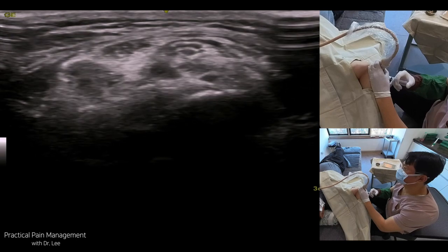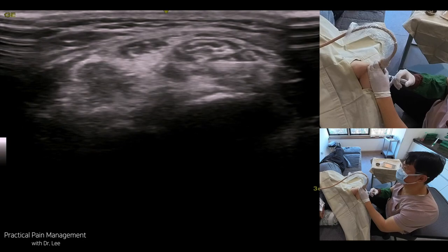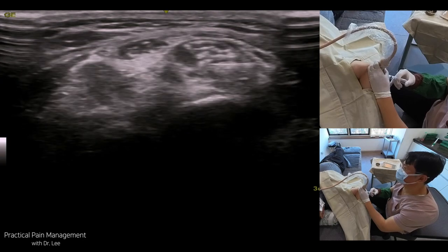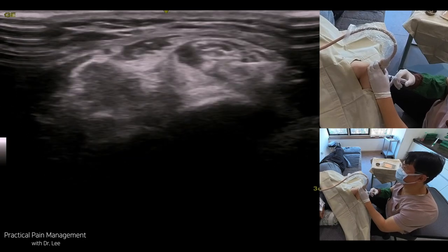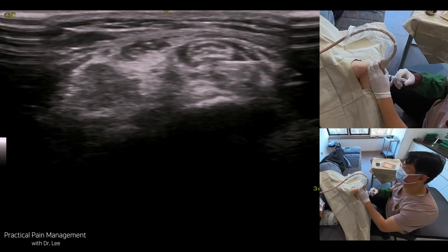Ultrasound-guided hydrodissection is a minimally invasive technique used to release entrapped peripheral nerves by injecting fluid to separate the nerve from surrounding tissues. Here is a detailed step-by-step technique for performing this procedure.